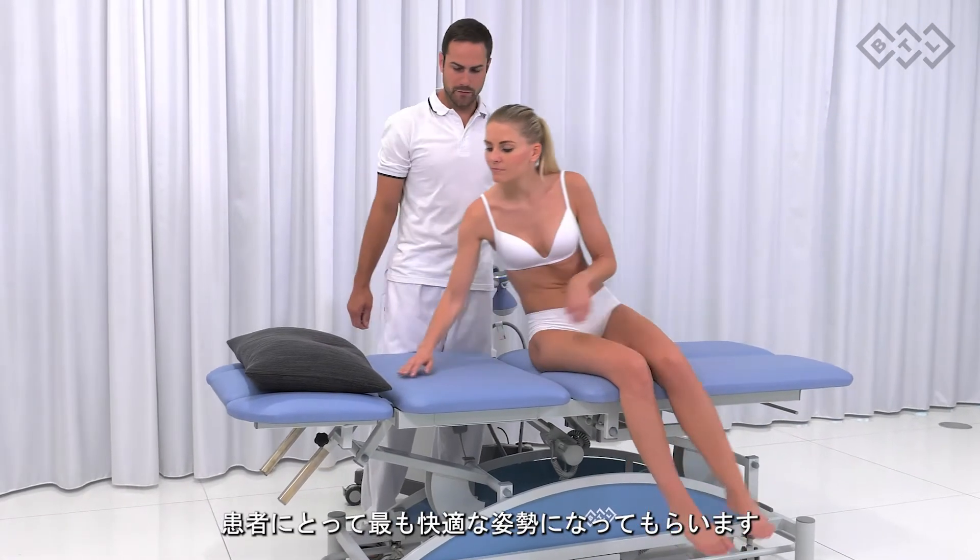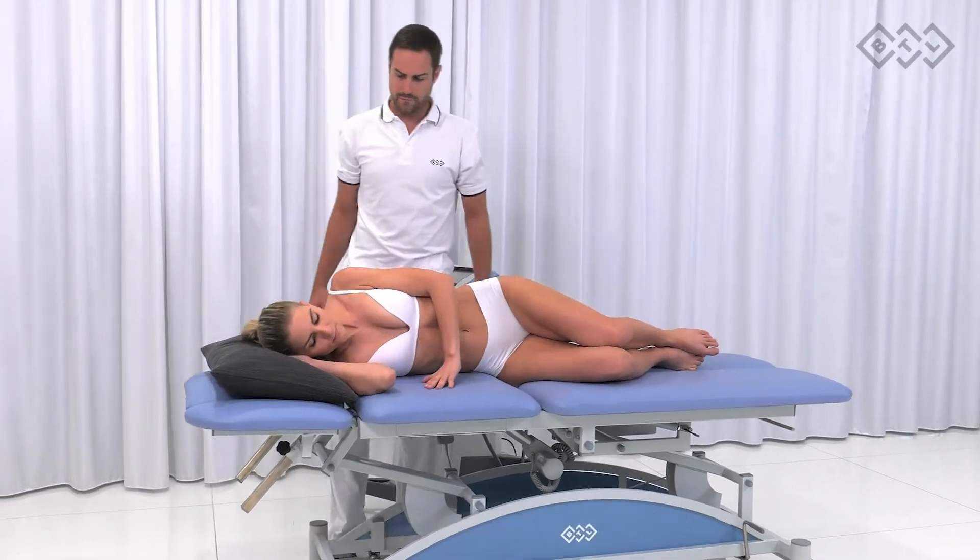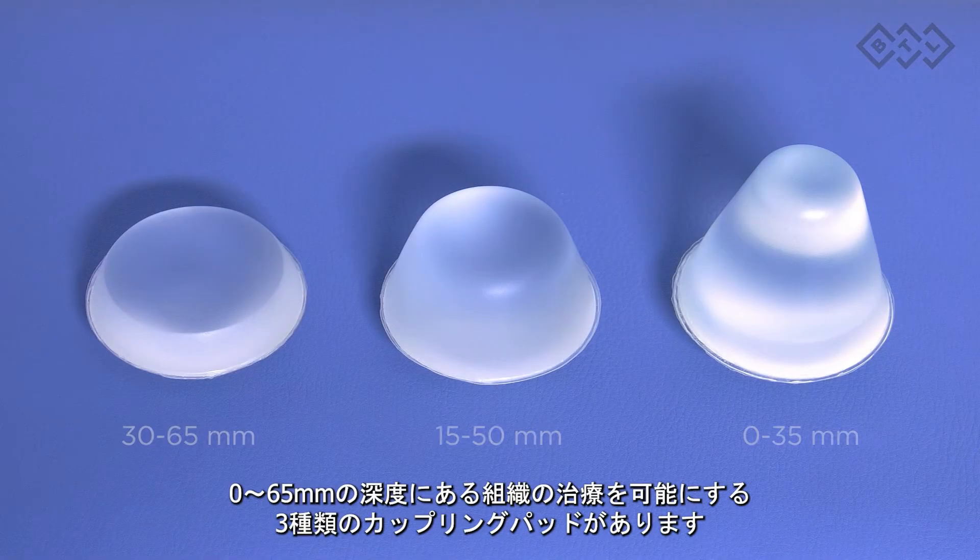What should be prepared before starting the therapy? Ensure the patient is in the most comfortable position — the most preferable is a stabilised lying position. Choose a suitable coupling pad according to the depth of impaired tissue. There are three sizes of coupling pads which allow for treatment of tissues lying in the depth within range of 0–65mm.